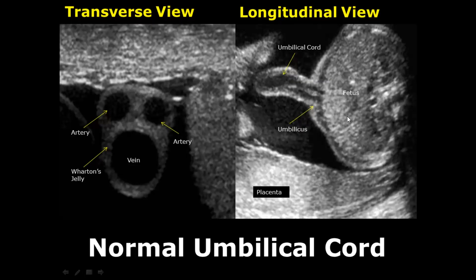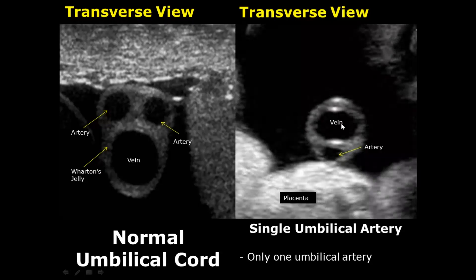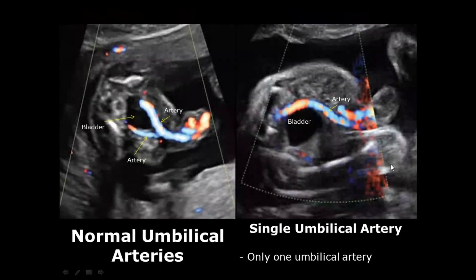Sometimes there may only be a single umbilical artery present. Here we can see only one umbilical artery in transverse view in its cross section. On color Doppler, we can further investigate a single umbilical artery.